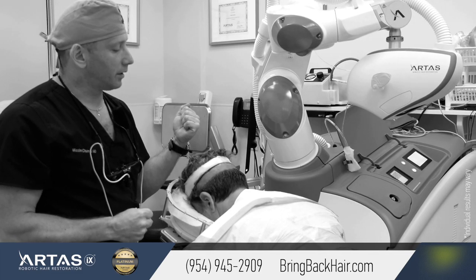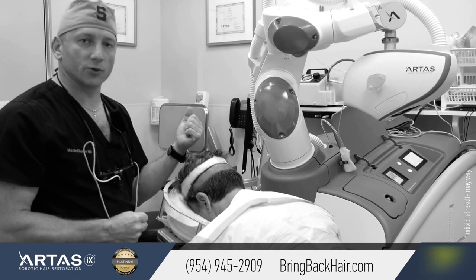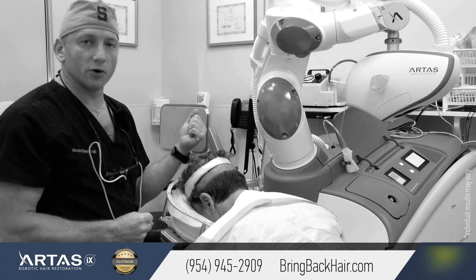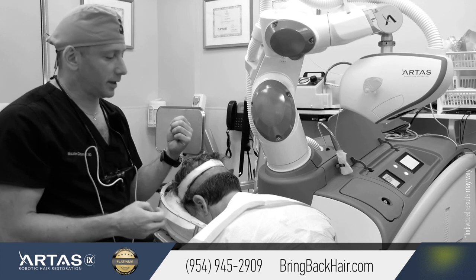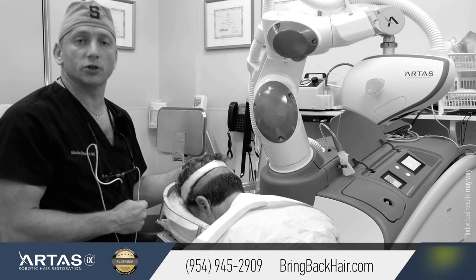We're using the ARTAS iX robotic hair system — the most recent upgraded version of the robot — with 30% faster extraction and increased precision.